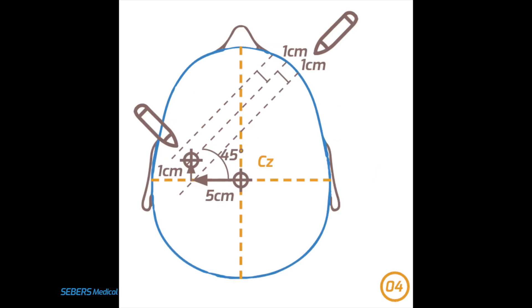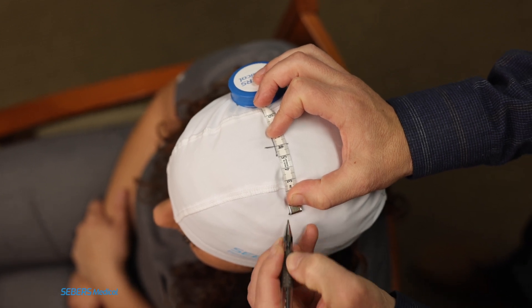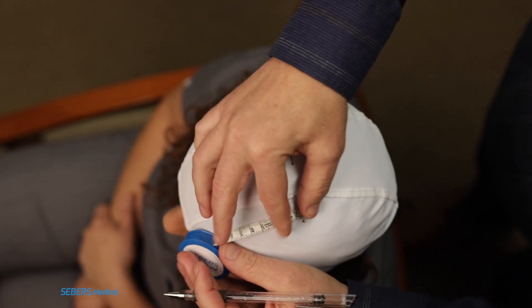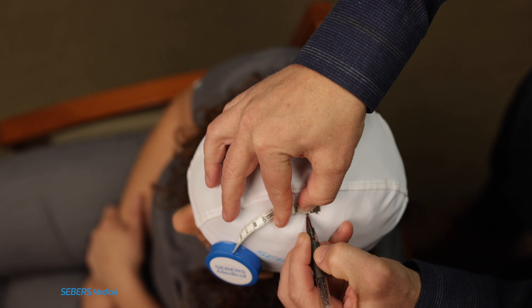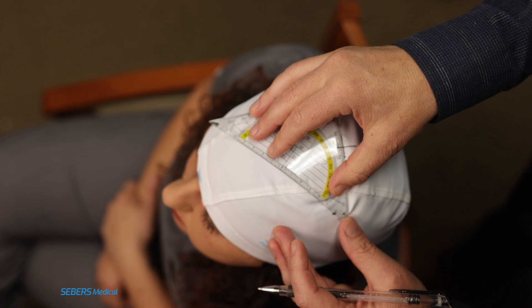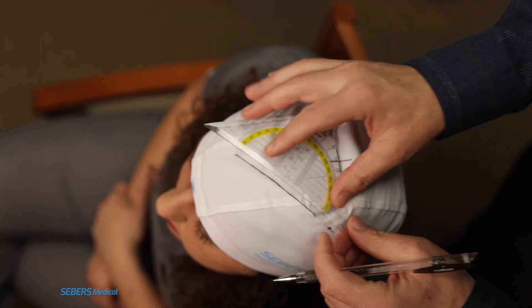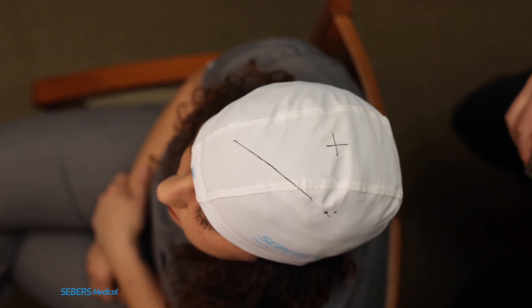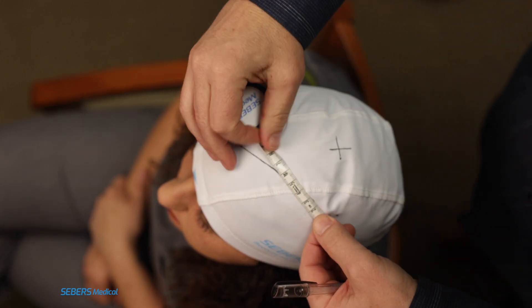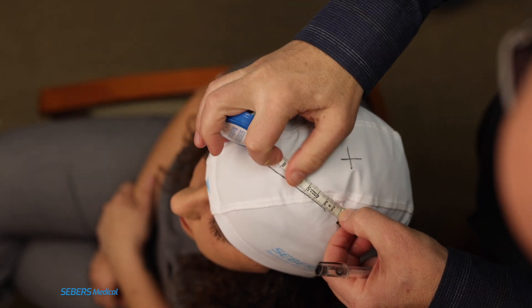Next, we're ready to define our motor hotspot search area. Start by measuring 5 cm laterally from the CZ on the left hemisphere. From there, move 1 cm upward, then measure 6 cm forward at a 45-degree angle. This is the length from the center of the coil to its edge — the pulse comes from the center, but since we can't see that, we use the coil's edge as a visual guide. We'll use this point to form a 9-point grid, moving in 1 cm increments in all directions. This grid is where we'll deliver single pulses to identify the optimal motor hotspot.